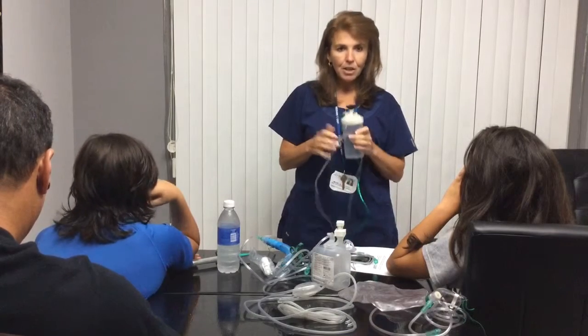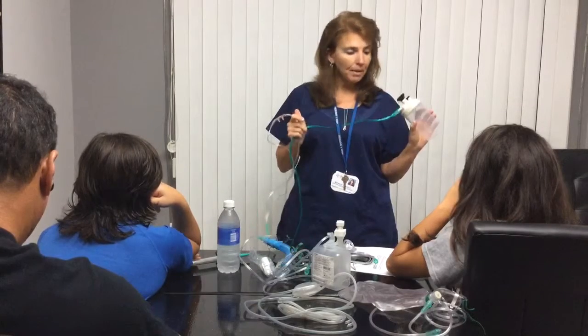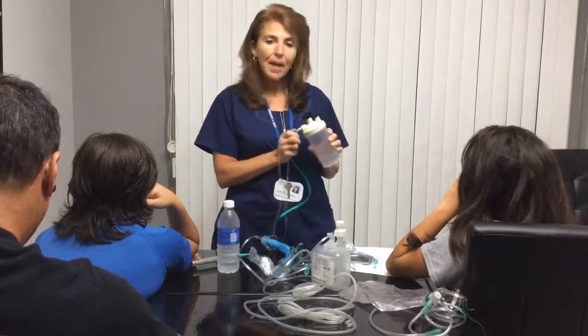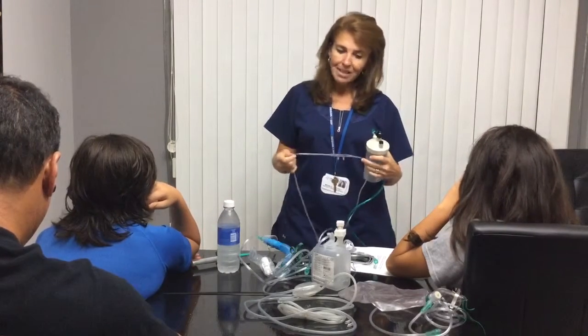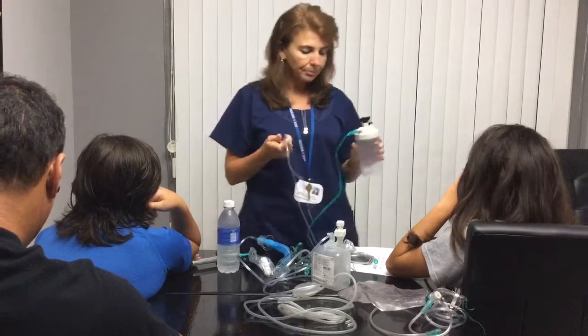The only disadvantage with this type of cannula is for transport. Because it requires humidity, you cannot connect this to our oxygen cylinders for transport. So at that point, you'd want to contact someone from respiratory therapy, and they can change the device type to either a non-rebreather or an oxymizer.